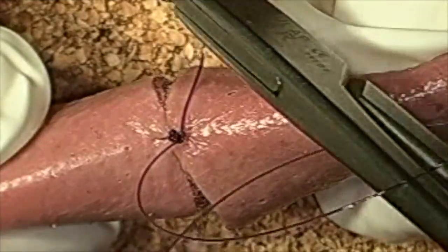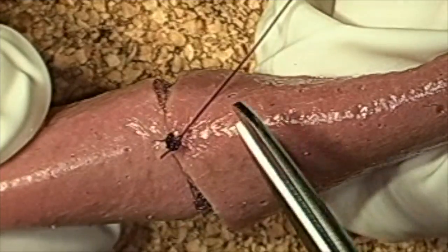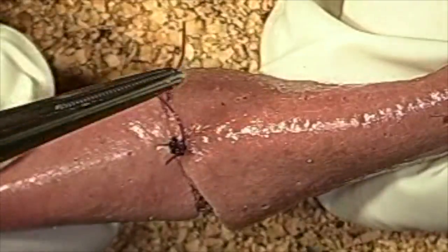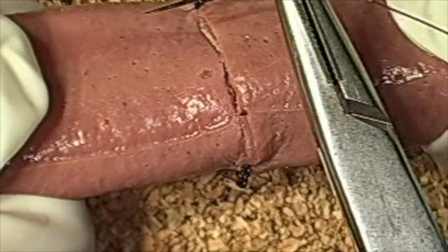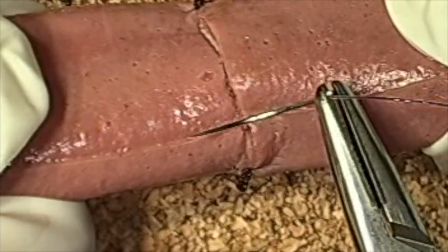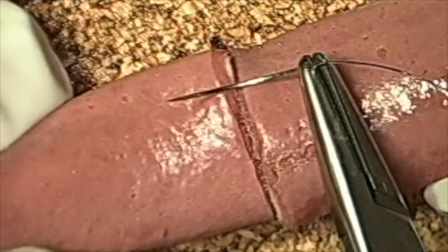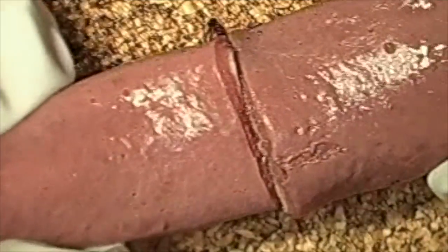You can see here we have a surgeon's knot plus four to six throws on top. Once we have this, we can then decide where we're going to put our other sutures. Typically, people try to put them a few millimeters apart. You can see here that I'm halving and quartering the segments, which I think is appropriate anywhere along this — so if you want to do it in quarters, it's great.